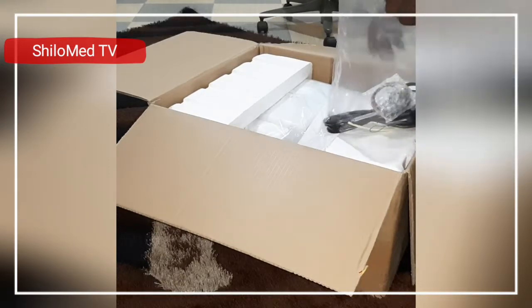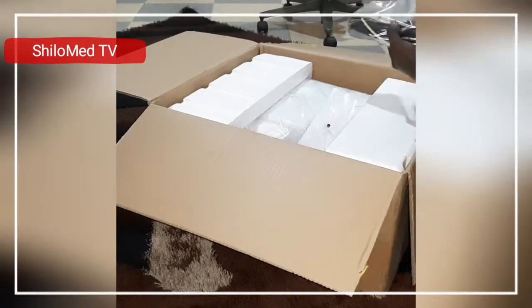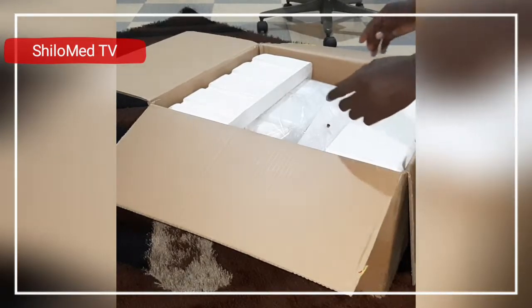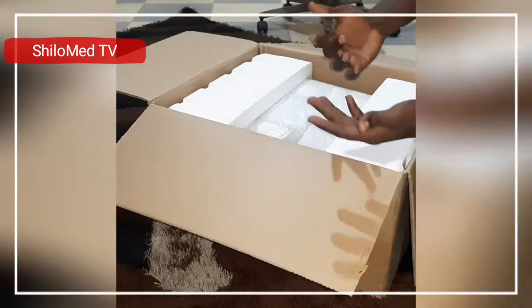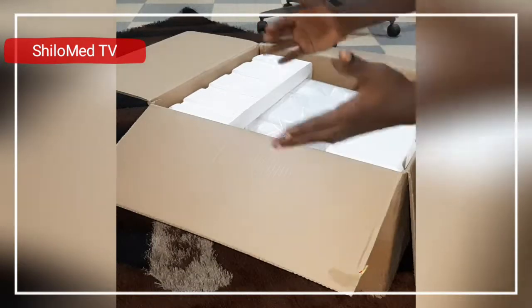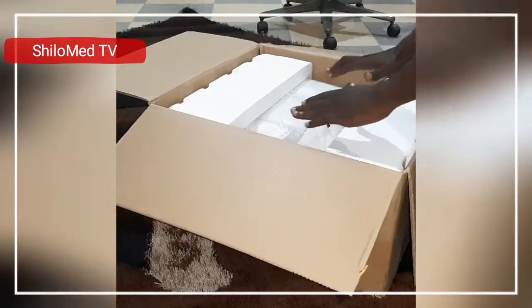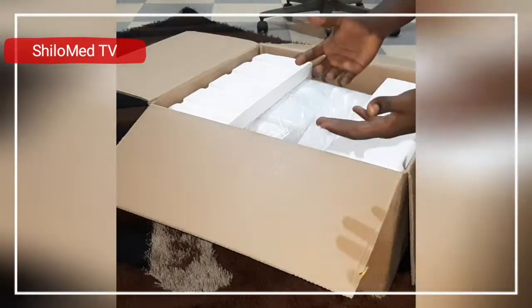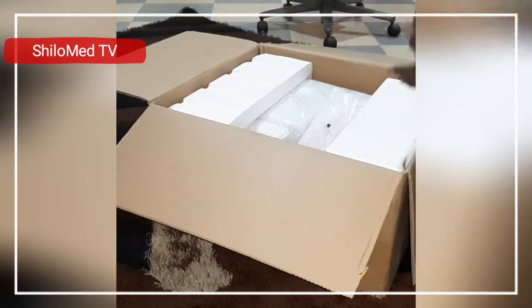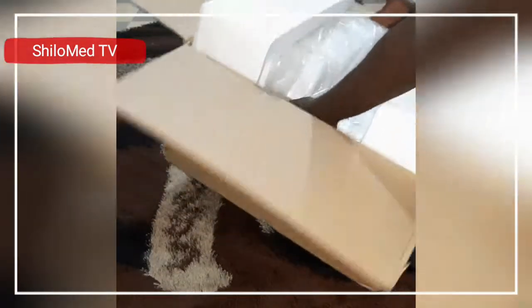It's always good to start a lab with a semi-automated analyzer because you don't really know whether people are going to patronize your lab or not. You don't have to waste all your money investing in a fully automated analyzer. Start with the semi-automated, which is cheaper, and as you build your clientele you can move up the ladder to the fully automated analyzer.